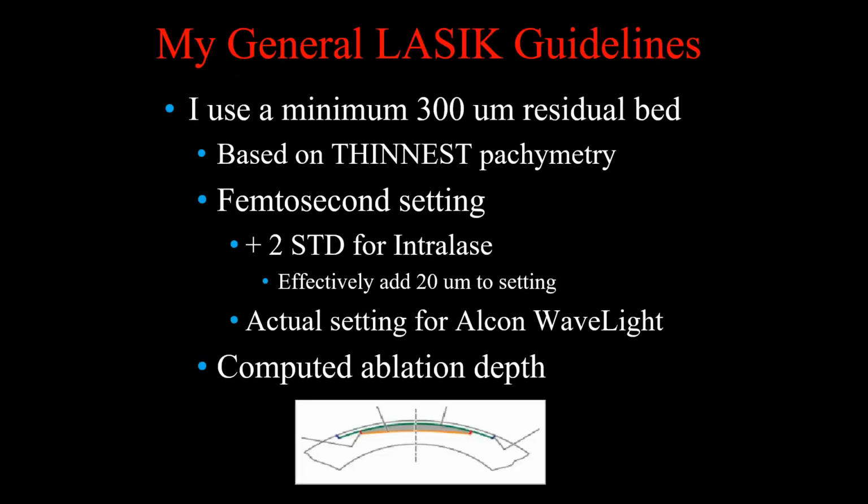I use a minimal 300 micron residual bed, and that's based on the thinnest pachymetry. And it used to be based on when I used an IntraLase femtosecond plus 2 standard deviations. The Alcon WaveLight, at least when we've done some comparison measurements, has a much tighter standard deviation. So on the Alcon unit, I just use the setting on the Alcon.